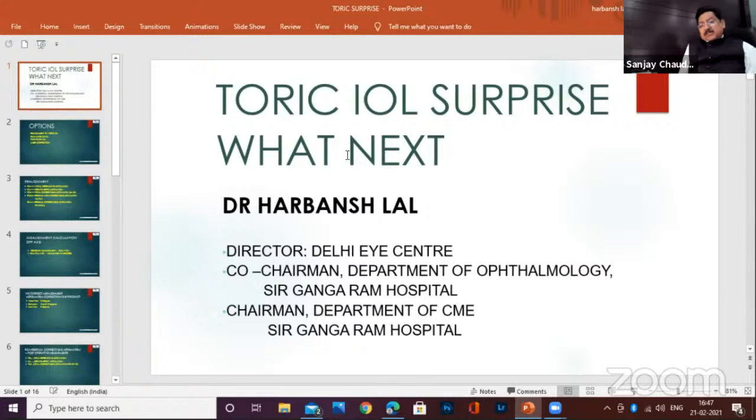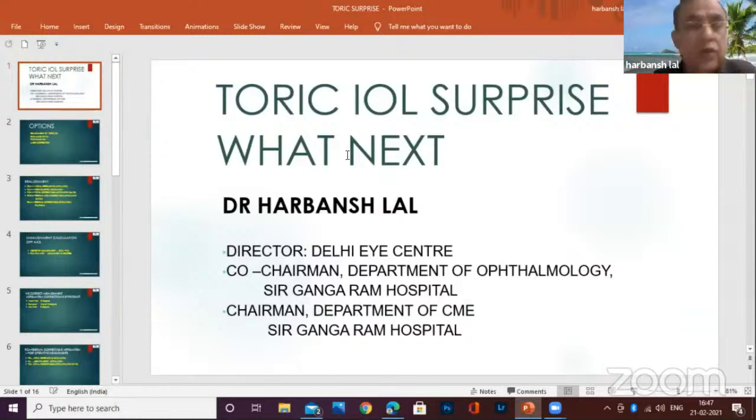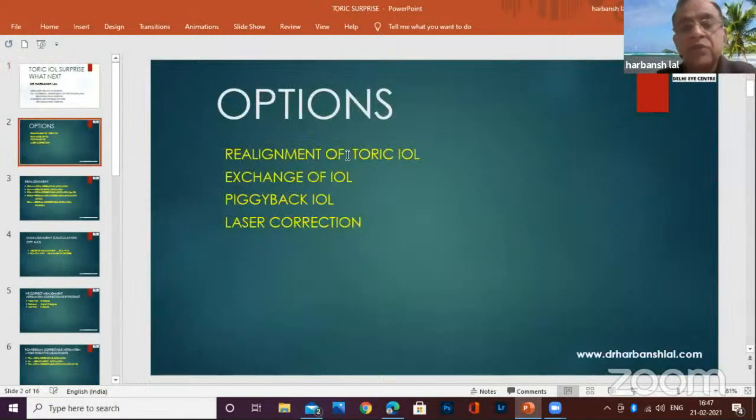Okay, so I'll be talking about toric IOL surprise. What next? So we put on a toric IOL, and if the patient still has astigmatism, what are the options we have? Realignment of the toric IOL, exchange of the IOL, piggyback IOL, or a laser correction.